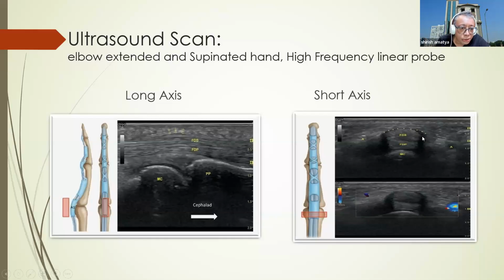And the pulley is not only the roof; in the lateral aspect of the flexor digitorum superficialis and profundus, you can see a triangular black anechoic area. This, along with the upper arch, is the A1 pulley.